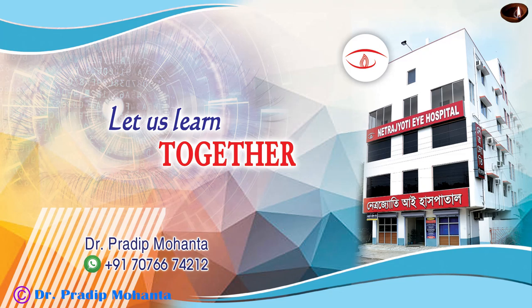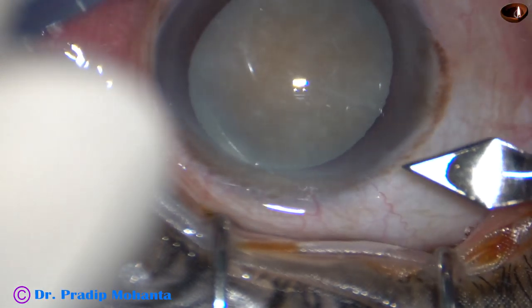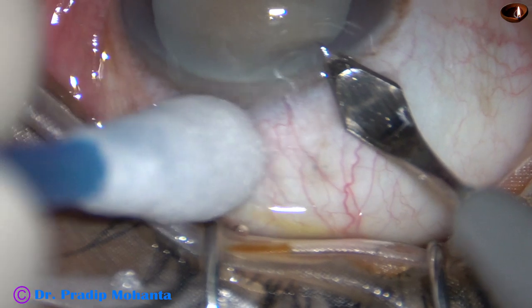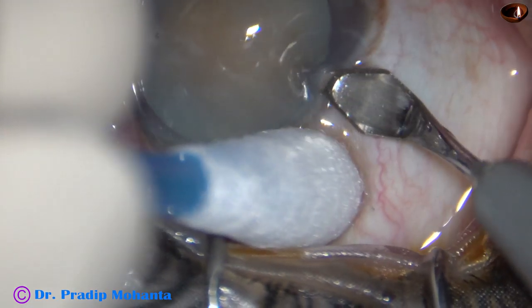Friends, welcome to my workplace at Rana Ghat, West Bengal, India. In this video, I am going to show a unique instrument designed by me called the posterior capsule protector.